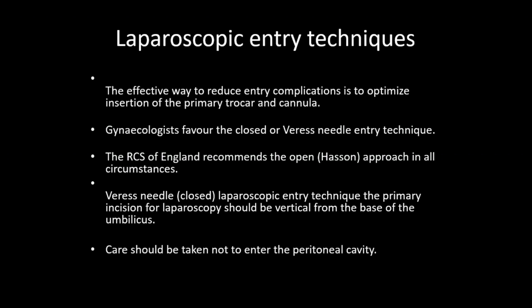After insertion of your primary port, which is the camera actually, you will start your procedure, either a diagnostic laparoscopy or even a surgical procedure.